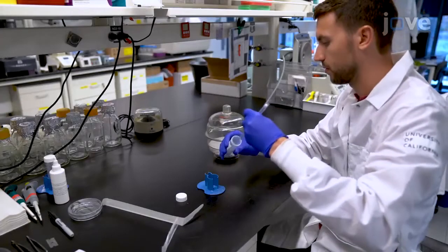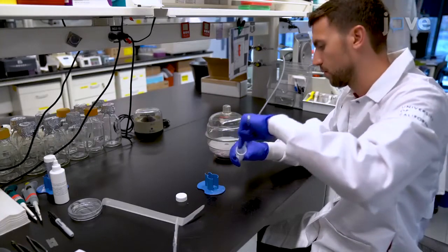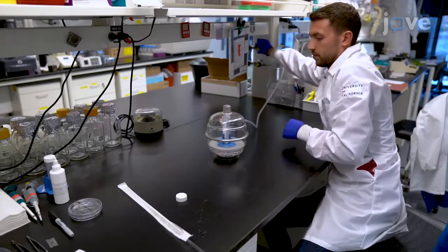To begin this procedure, mix PDMS base with PDMS curing agent at a 10:1 ratio by weight and mix thoroughly. Degas this mixture in a desiccator for 30 to 60 minutes or until all of the air bubbles are removed.